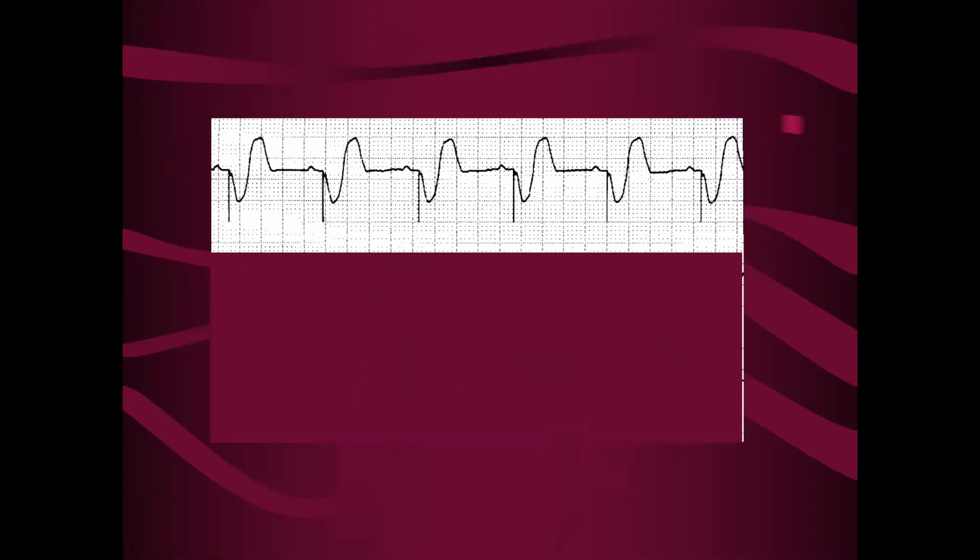So if you have a patient, and this looks like a perfectly normal ECG, a baby for example, tracking along at 160 beats per minute, and then suddenly you see the rate drop down to maybe 90 beats per minute from 160, then you need to be suspicious that it could be that the pacemaker is somehow tracking every other P wave. So that's why, looking at an isolated strip like this, it looks like normal pacemaker behavior.